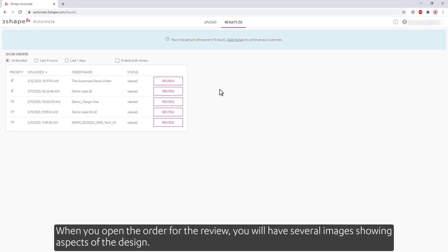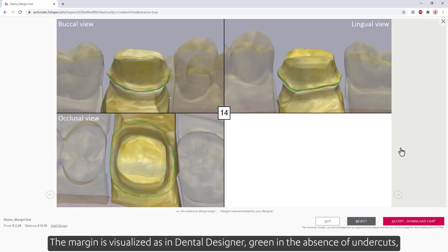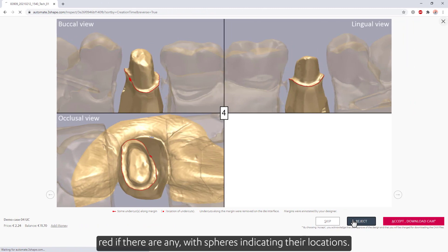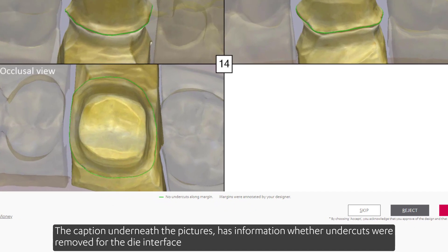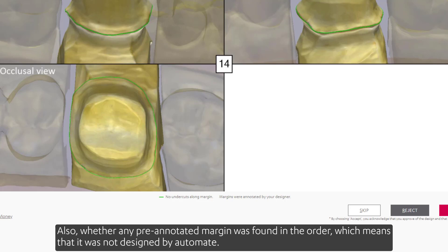When you open the order for review, you'll have several images showing aspects of the design. The first is the margin, visualized as in Dental Designer — green in the absence of undercuts, red if there are any, with spheres indicating their locations. The caption underneath the pictures has information about whether undercuts were removed for the die interface or weren't removed due to the default setup in the Design Preferences section, and also whether any pre-annotated margin was found in the order, meaning it was not designed by Automate.